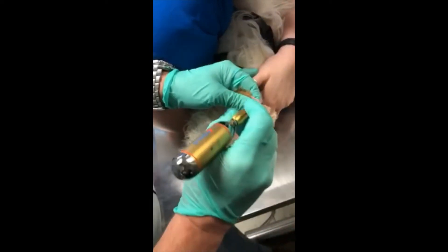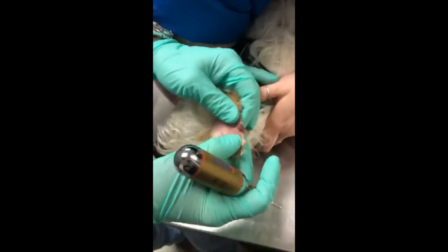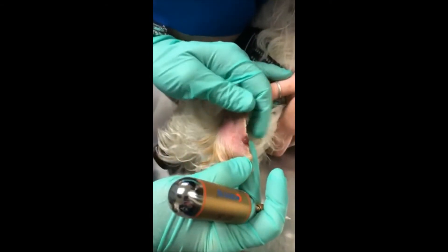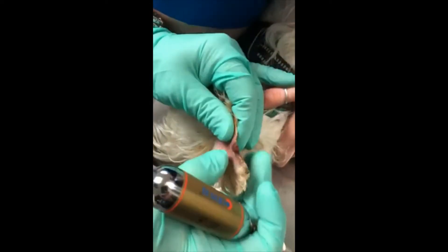I have both shaved this area and infiltrated with a small amount of lidocaine with epinephrine, only because it's along the ear margin and I suspect it's going to be a little sensitive.